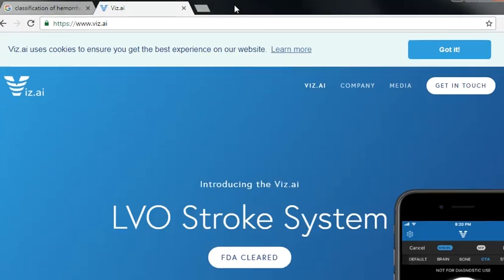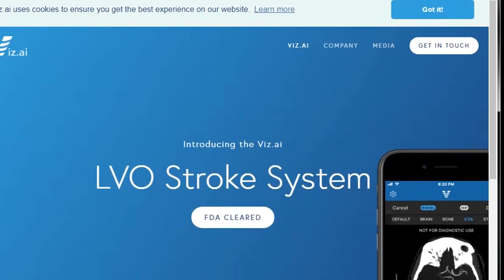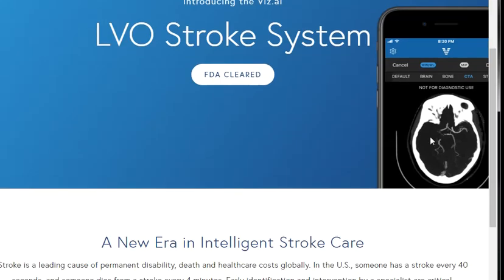The reason I mention this case is because the FDA cleared the Viz.ai company to use artificial intelligence to detect large vessel occlusion from the scanner, which will alert all the interventionalists and radiologists, just like the RAPID program. Supposedly this will be done in small rural hospitals so that they can initiate the transfer process.